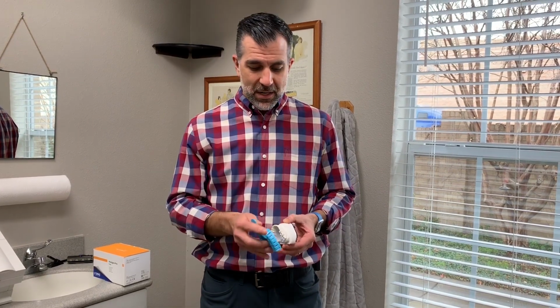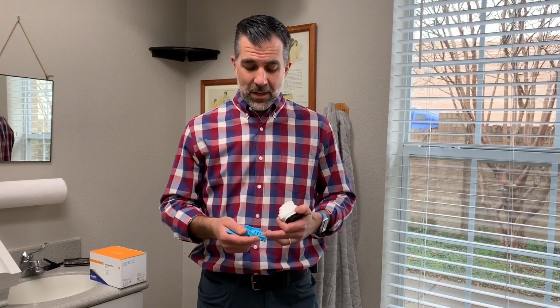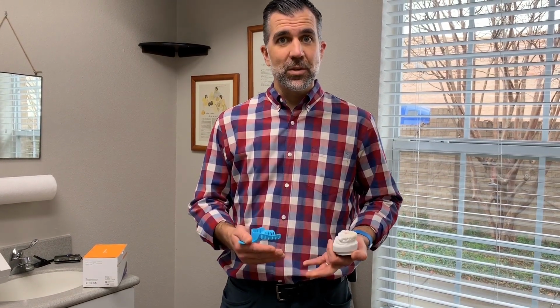We take a stock tray, verify that it fits over the wax up. Next, I like to create separation or use a separating medium. On these cases, I like to use Vaseline, a real thin layer of Vaseline. We'll also paint the tray with a VPS adhesive. Then to fabricate the matrix, we'll use Honigum Pro Putty, an auto-mix putty from DMG Corporation. So we're going to paint our tray, and we're going to paint our model with Vaseline, and then we'll get started.